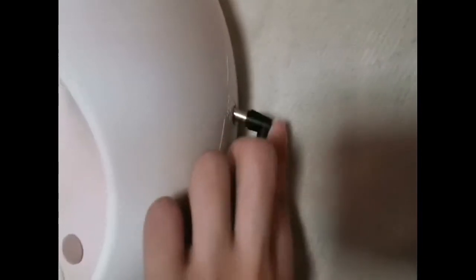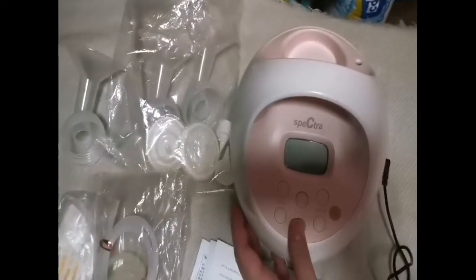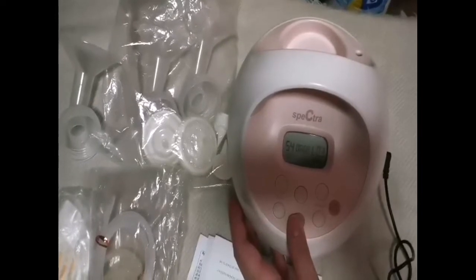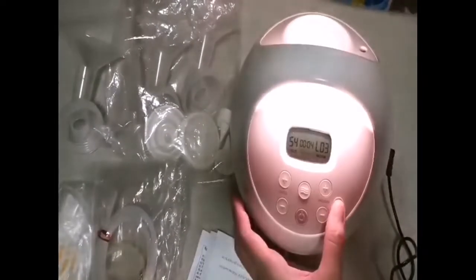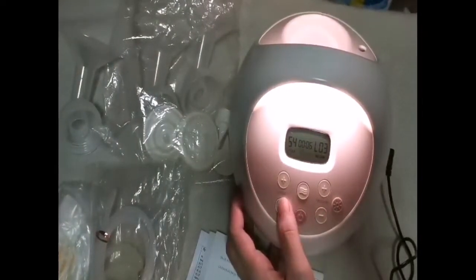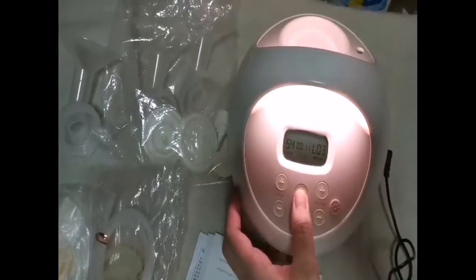The Spectra S2 is a breast pump that needs to be plugged in — it is not a portable breast pump — so you really need the charger to make it work. Here I'm putting the charger on and turning it on. As you can see there's a light, so this is great for breast pumping at night.